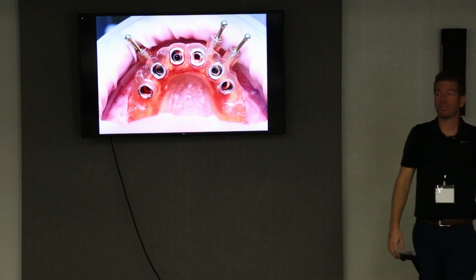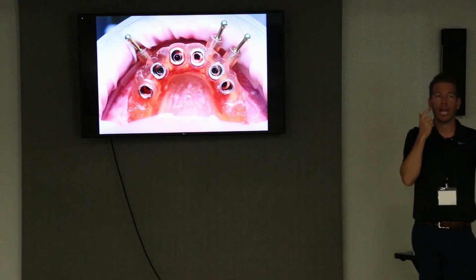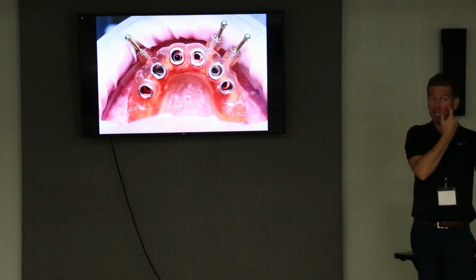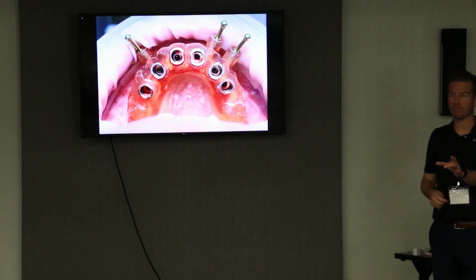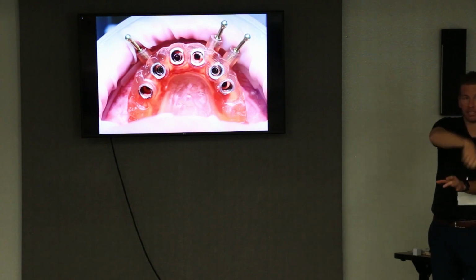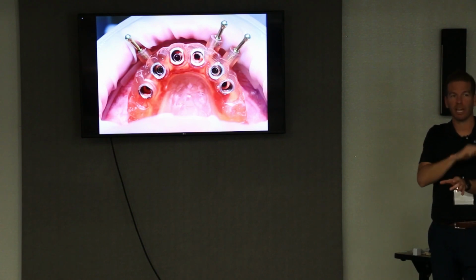So here's what I would do. This is how I would do those cases going forward. I would duplicate the denture, but add 3 pins, dead center, and then kind of the left and the right. Put it on the soft tissue, drill 3 pinholes, okay? Then take the denture off. Don't put the pins in yet.